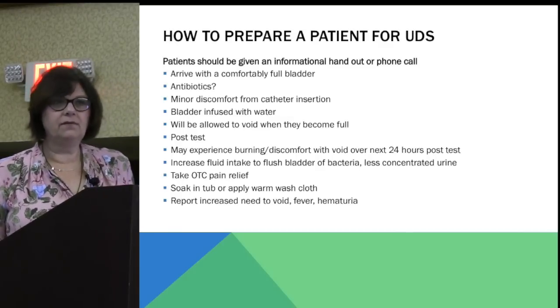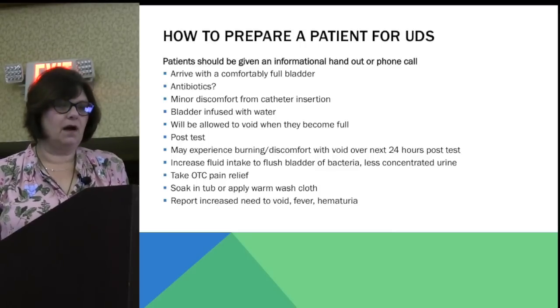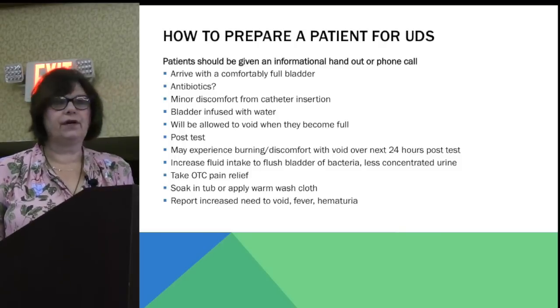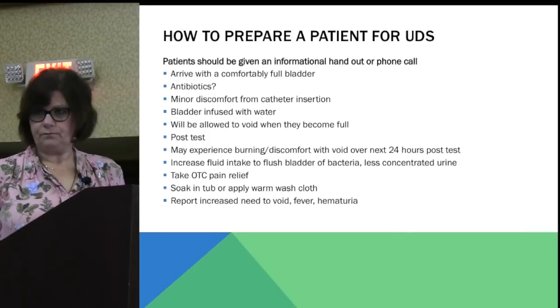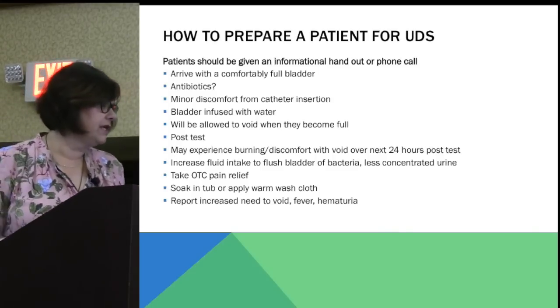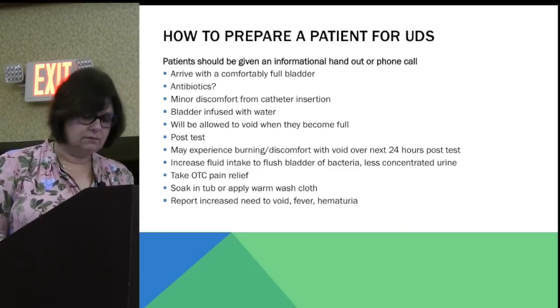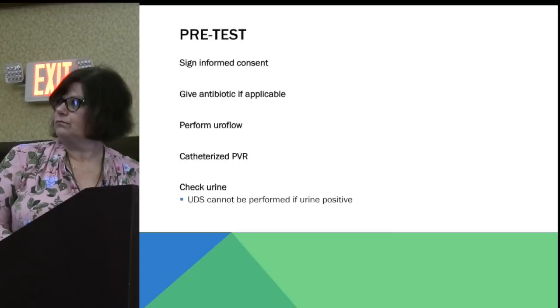They can take an over-the-counter pain relief, Motrin, whatever they can take. I advise them to do that after they leave the test to deal with some of the discomfort from putting in the catheters. You can also tell them to soak in a warm tub or apply a warm washcloth down below. And again, we talked about the increased risk for UTIs, so let us know if they're unable to void, have an increasing desire to void, or have fever or hematuria.